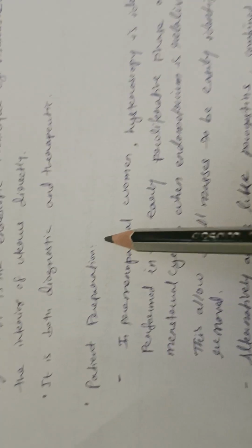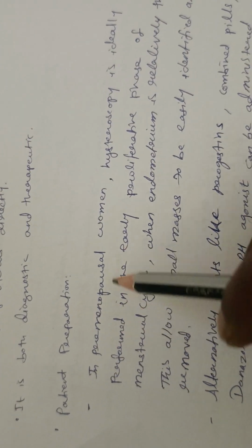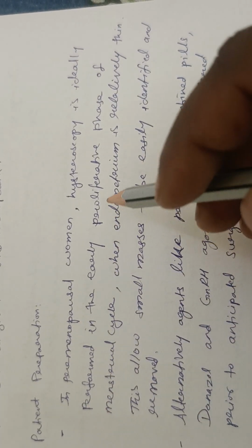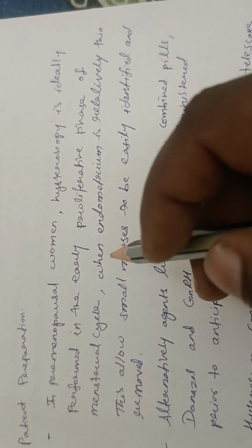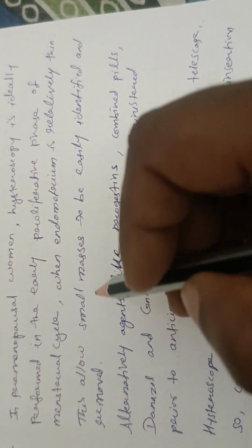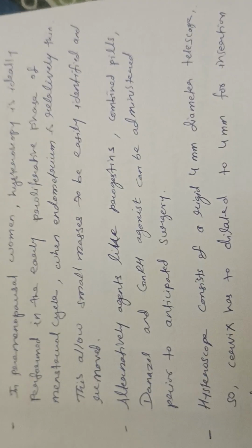Patient preparation. In premenopausal women, hysteroscopy is ideally performed in the early proliferative phase of menstrual cycle when endometrium is relatively thin. This allows small masses to be easily identified and removed.